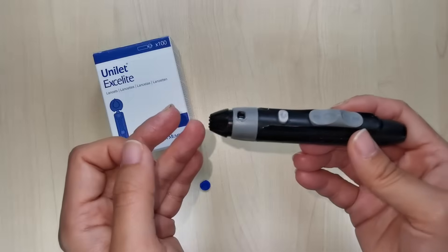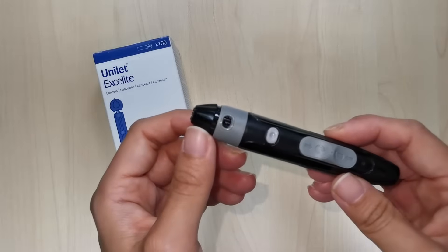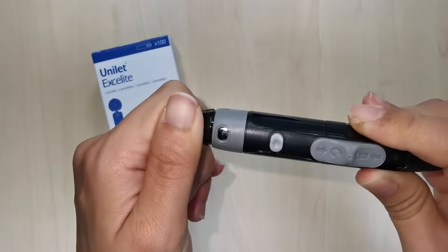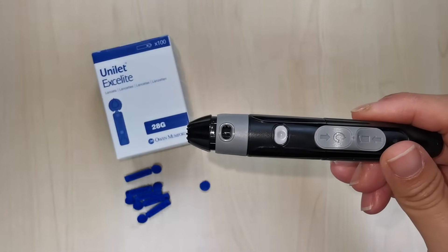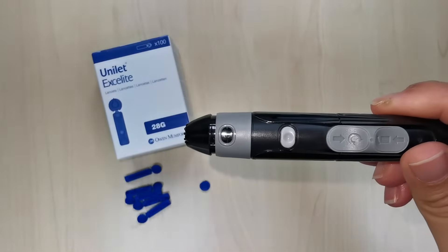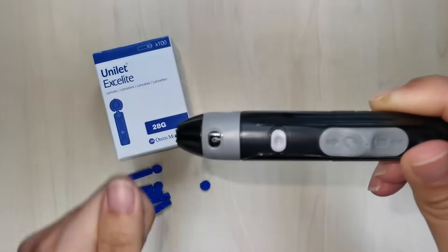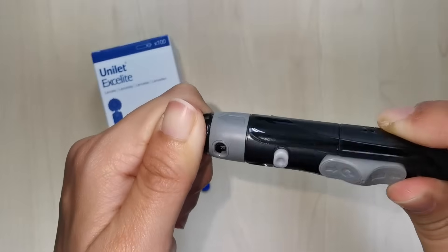Before you prick your finger, you need to set how deep you want the needle to penetrate using the depth adjuster. The Autolet Plus has 9 depth settings. Level 1 is the shallowest depth, while level 9 is the deepest. Level 1 to 2 is for very thin or bruised skin; level 3 to 4 is probably best for average skin; and level 5 and above are suitable if you have very callous fingers. I'm setting number 3 for my skin.